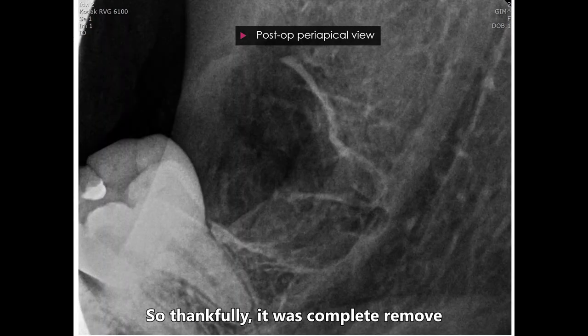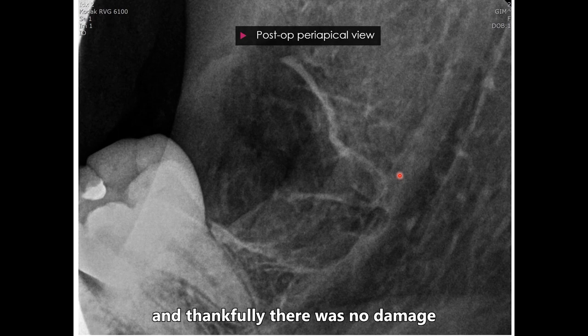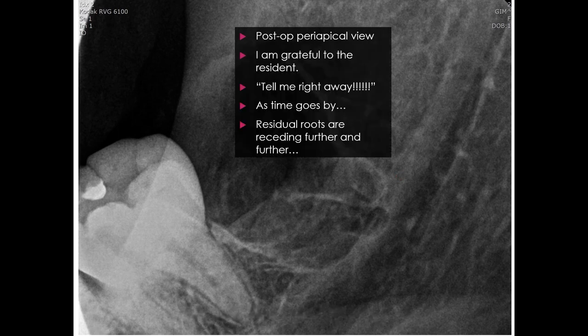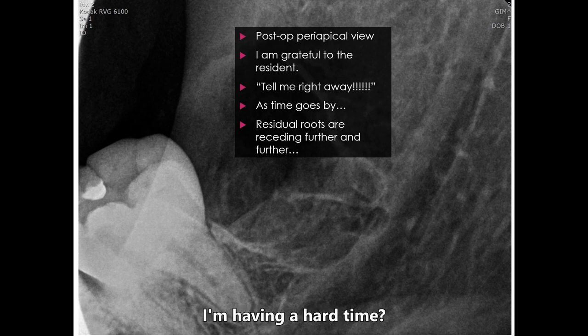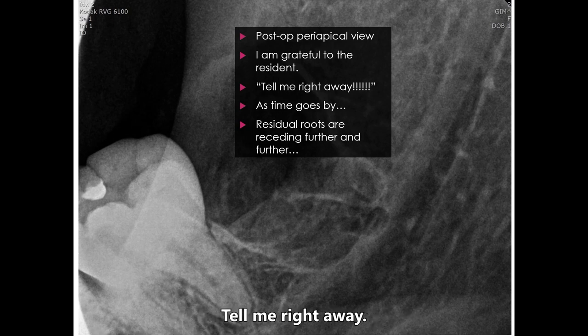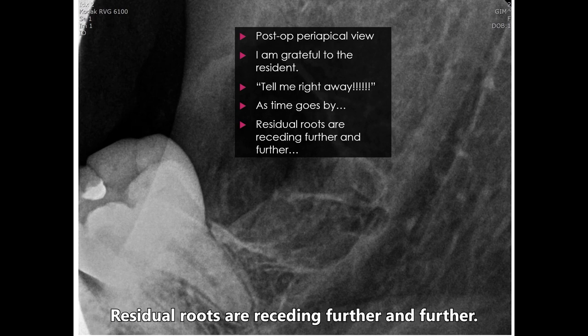Thankfully, it was completely removed and there was no damage to the lingual nerve. I am grateful to the resident — tell me right away. As time goes by, residual roots recede further and further.